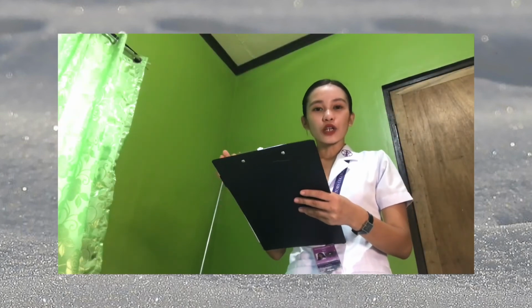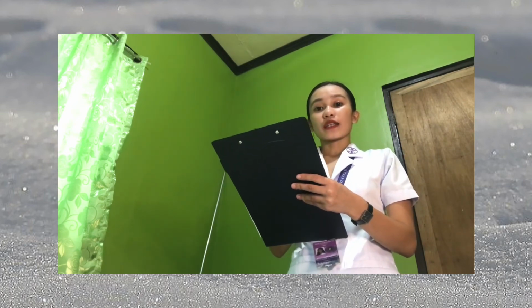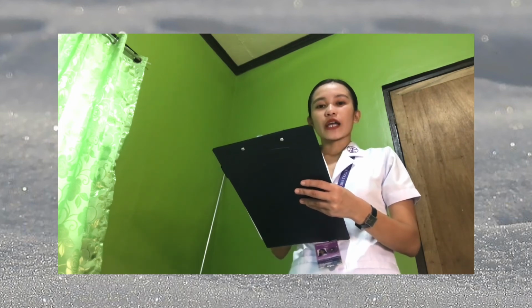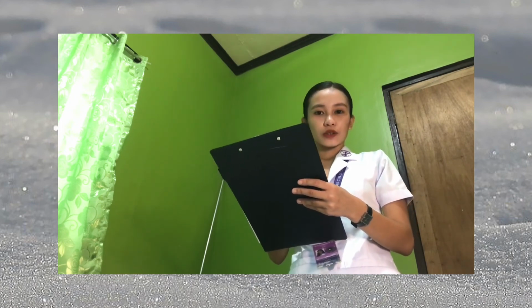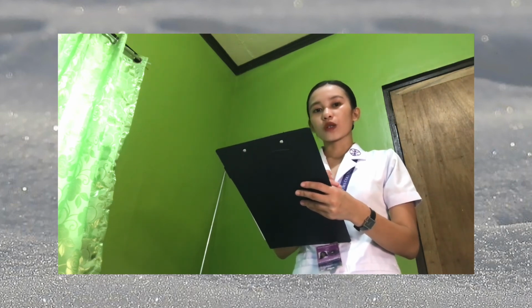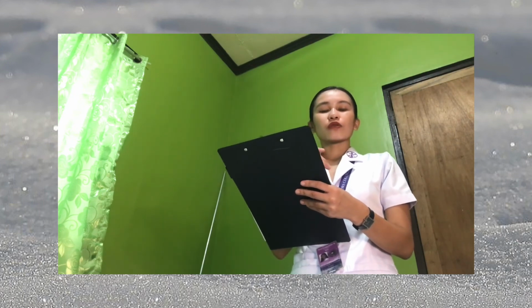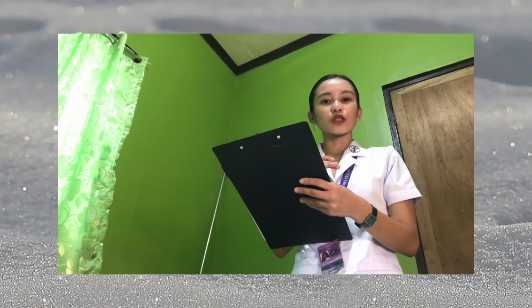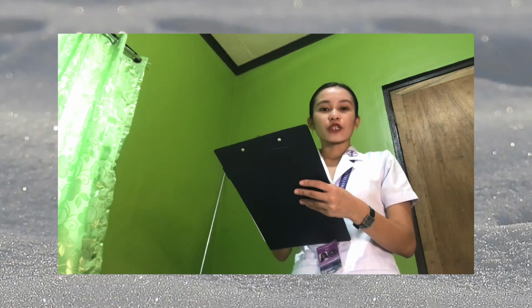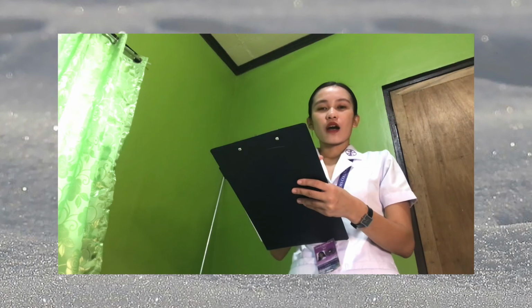For the documentation of the urinary catheterization, always include the date and time of the procedure and the type and size of the catheter used. I used a two-way Foley catheter, latex silicone coated. Its size is 16 French. Also record the amount of fluid used to inflate the balloon. I used 10 cc of sterile water. Also document the character and amount of the urine, the reaction and response of the patient, and include other significant observations.